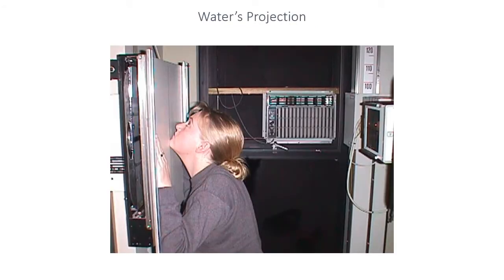This photograph shows a patient in a Waters projection, and you can see that this is a young patient who's very likely to be able to move quite freely, and yet it's still quite an uncomfortable position. You can see that the neck has been extended quite a long way.